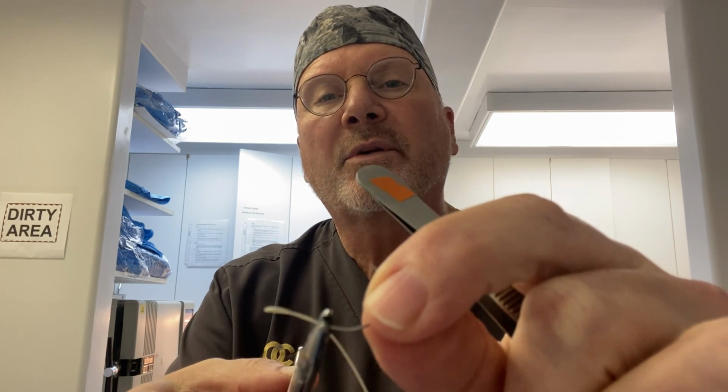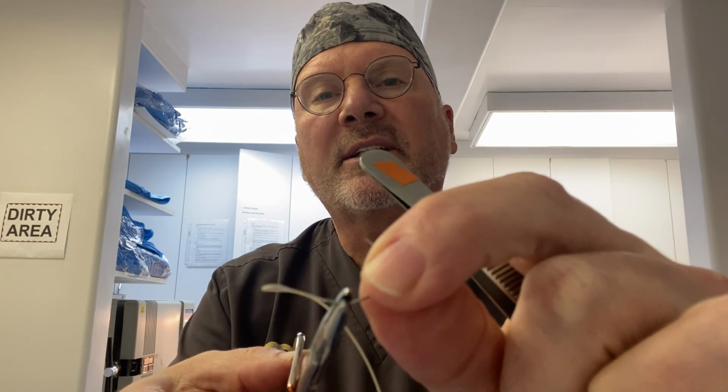That area, the thread goes in the metal for a certain distance, then they pinch the steel down on it to grasp on. If you grasp that and you change it from round shape to flattened, maybe it's going to let go of the suture and you're going to ruin the suture. So you can't grasp it any further back than one third of the way towards the tip. So we're going to start sewing on some tissue in a minute.